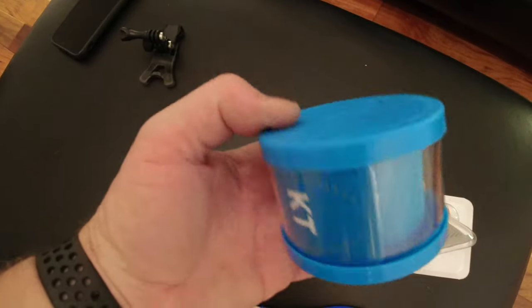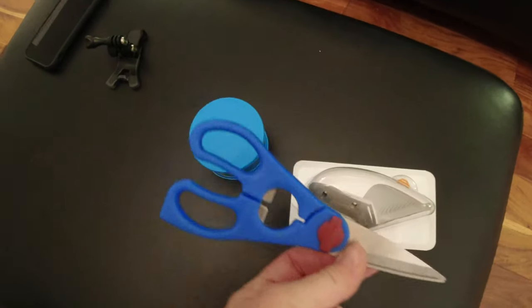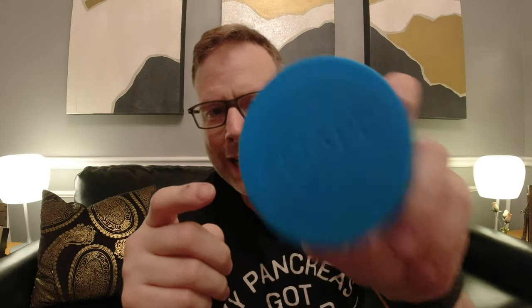I've got my Dexcom right here and I have KT tape — that is key — and a pair of scissors. You can buy KT tape at Walmart, at Target. Amazon has the cheapest prices. You can get it in just about any kind of color or pattern that you want, but the different patterns will cost you a little bit more.